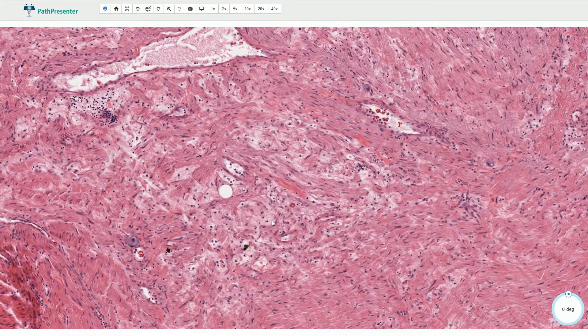This is the typical morphology of a ganglioneuroma. It is a mature benign neoplasm that originates from neural crest cells, either of the sympathetic ganglia or of the adrenal medulla. We can find it usually in the retroperitoneum, or less commonly in the adrenal gland, as in this case.